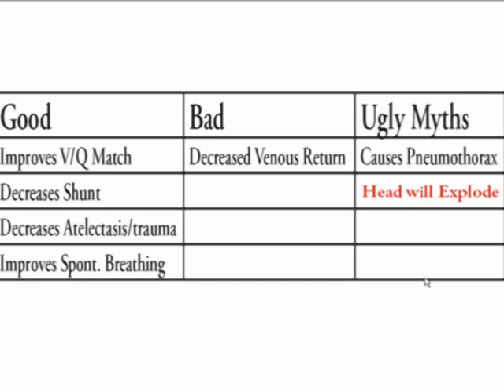Now there is bad. The bad is that venous return will be decreased, and these patients will need additional fluid to get back to that nice cardiac output level they were before PEEP. That's okay. We can work with that. But the myths are that PEEP causes pneumothorax. PEEP does not cause pneumothorax, and that the patient's head will explode.